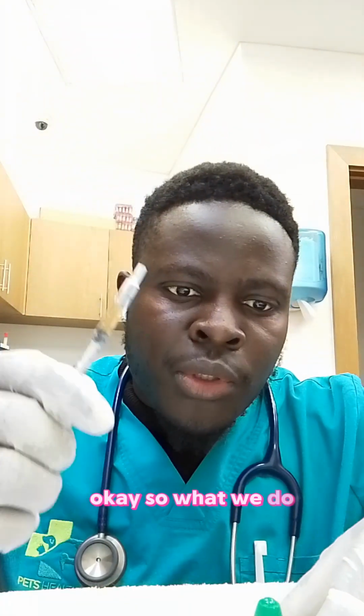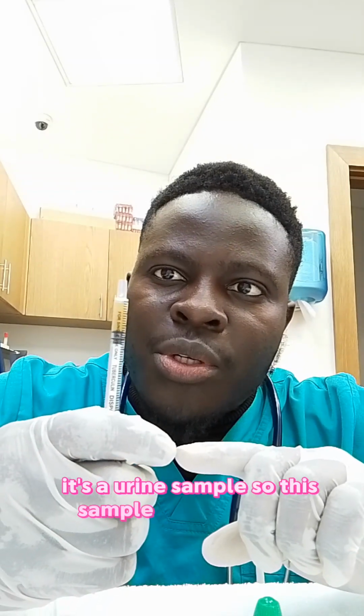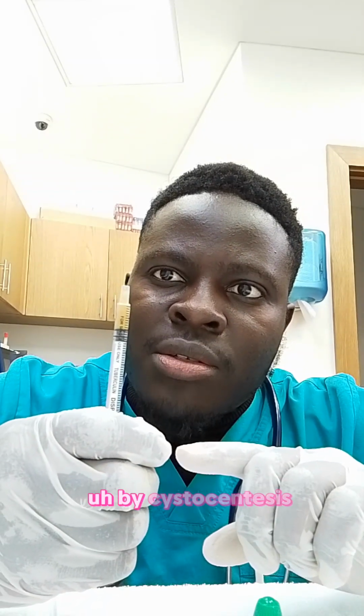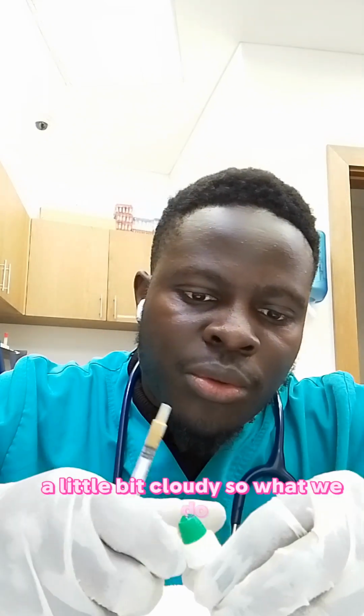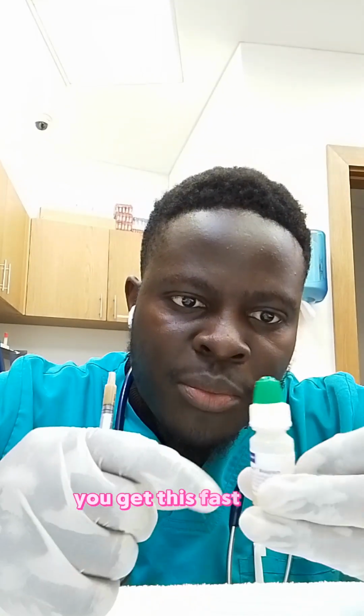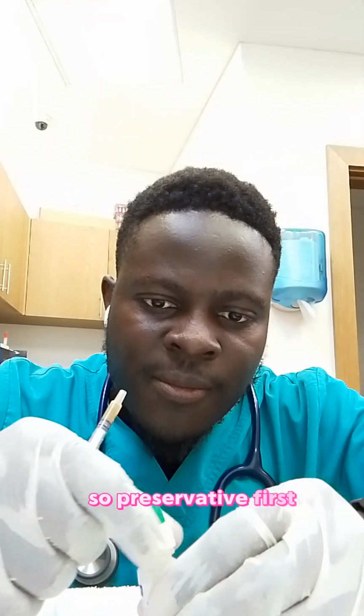So what we do, you get your sample. This is our sample. It's a urine sample. This sample was collected by cystocentesis, but you see it's a little bit cloudy. So you get this first bottle, the one which is the preservative. So preservative first.